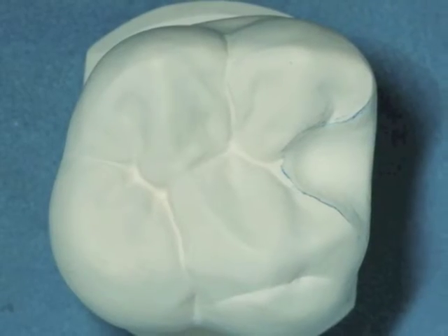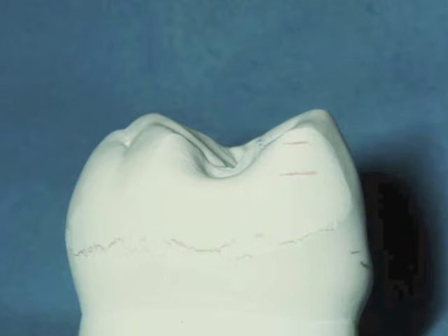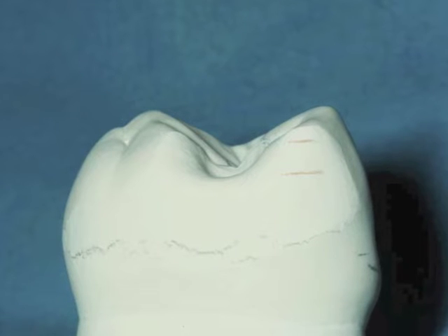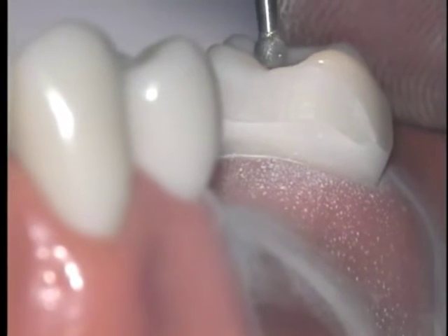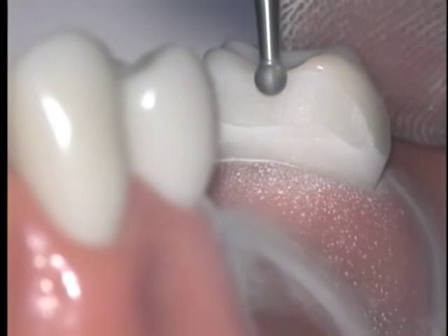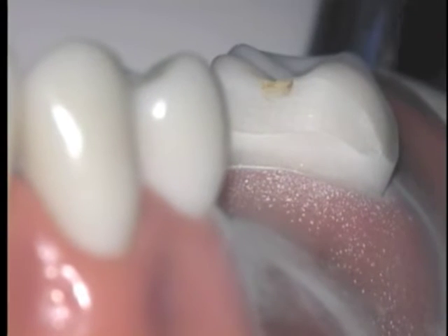The occlusal rest seat has a rounded triangular form from the occlusal view. From a proximal view, the most critical aspect is that the marginal ridge is reduced to provide 1.5 mm of clearance from the opposing tooth. The easiest way to ensure sufficient reduction of the marginal ridge is to place your burr on the side of the marginal ridge with the tip 1.5 mm below the ridge itself.